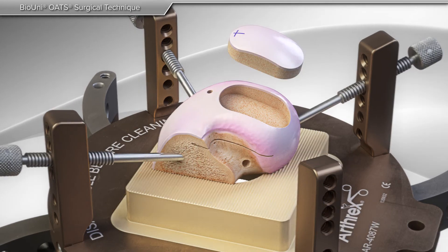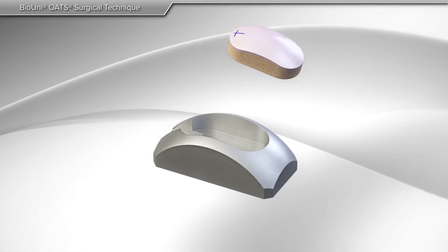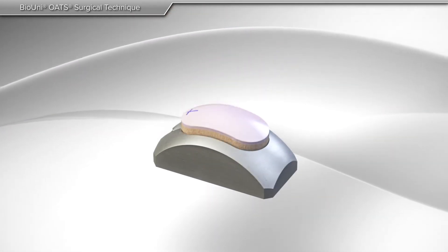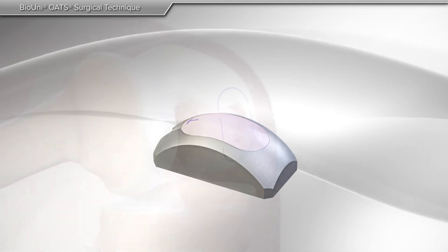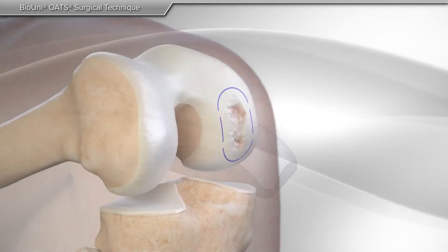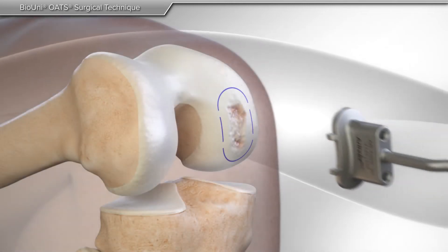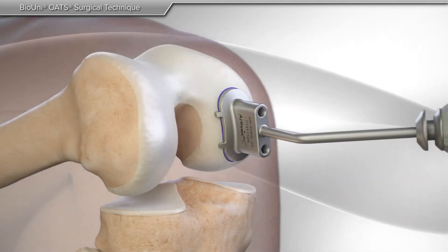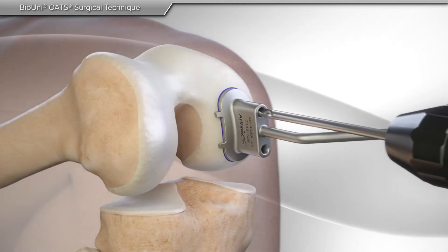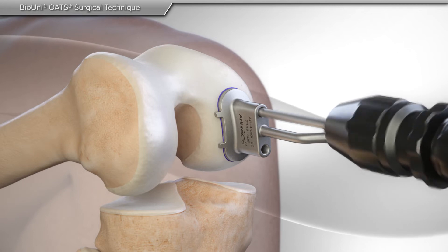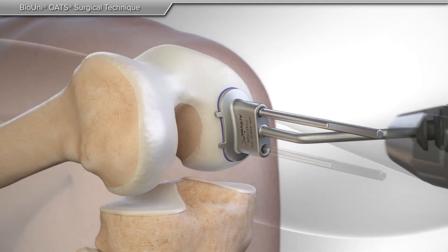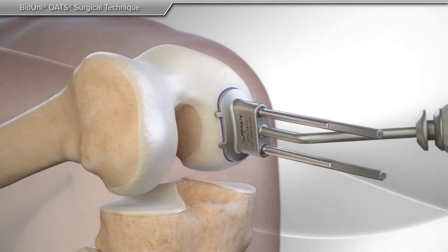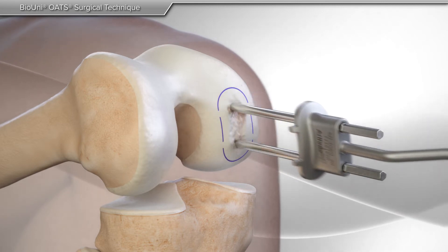Once the allograft is made, your surgeon prepares your knee for implantation. The area of damaged tissue is measured and removed through a sequence of steps designed to prepare the site for the allograft.